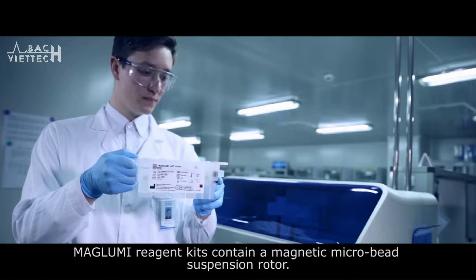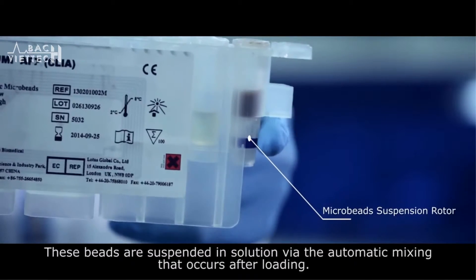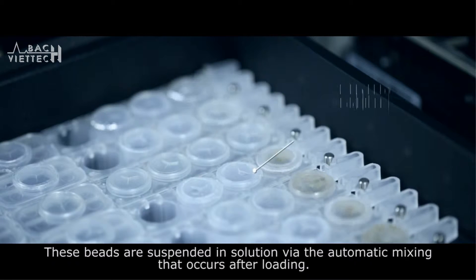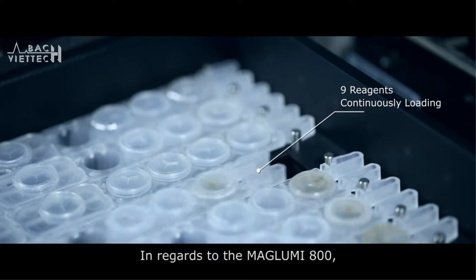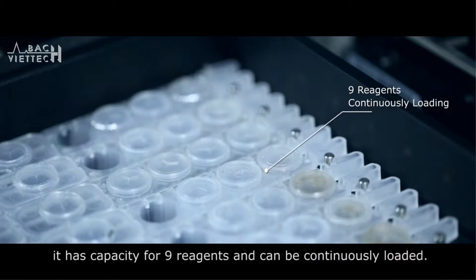MAGLUMI reagent kits contain a magnetic microbead suspension rotor. The microbeads are suspended in solution via automatic mixing that occurs after loading. The MAGLUMI 800 has capacity for 9 reagents and can be continuously loaded.